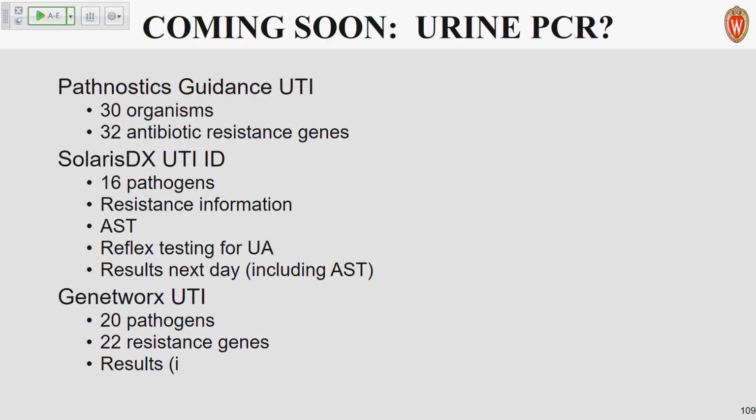The last slides there were just that urine PCR exists. There are maybe 4 vendors out there that have a urine PCR test. It's not reimbursable from Medicare, so it's very limited application right now. Obviously, it's not going to tell you contamination versus pathogen, so maybe in the future you'll see it coming our way, but I don't think it'll be anytime soon.